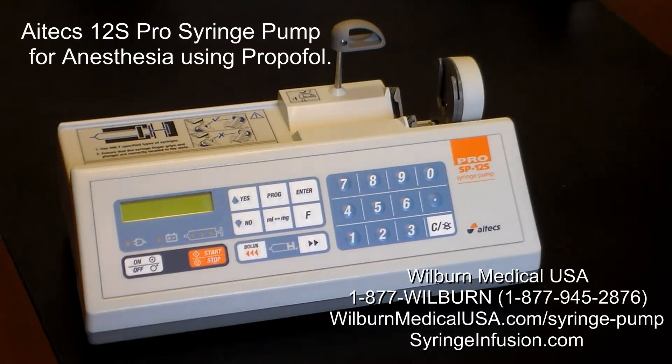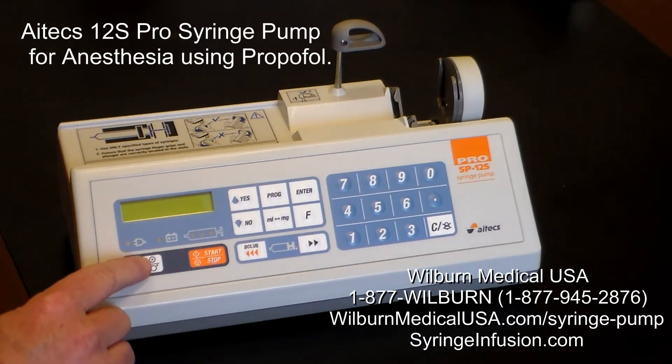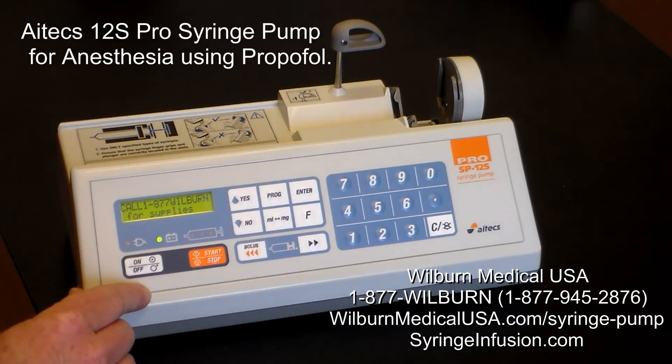Good day. We're here to talk about proper operation of the ATEX-12S syringe pump for anesthesia using propofol applications. It's a very simple, very cost-effective device.